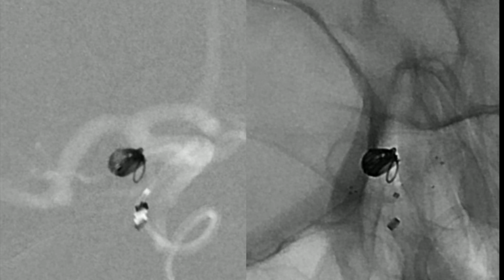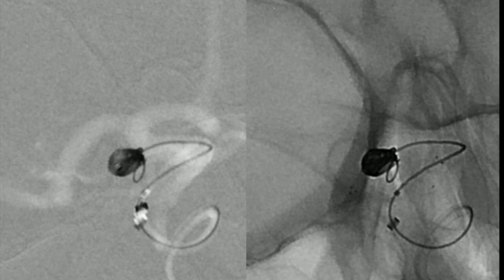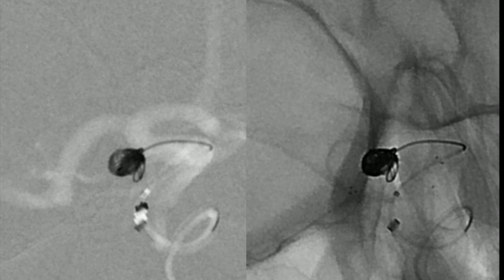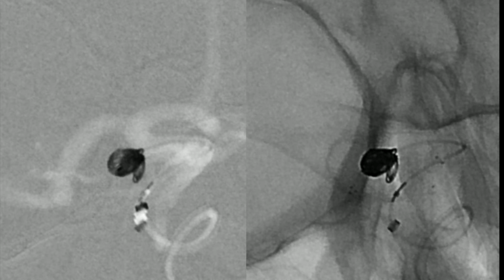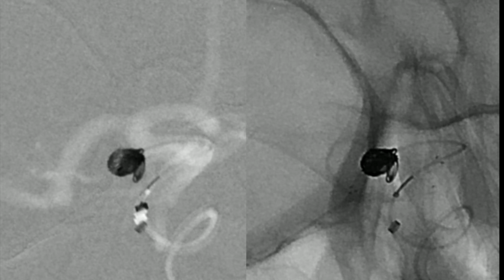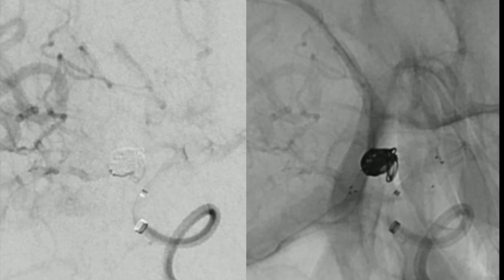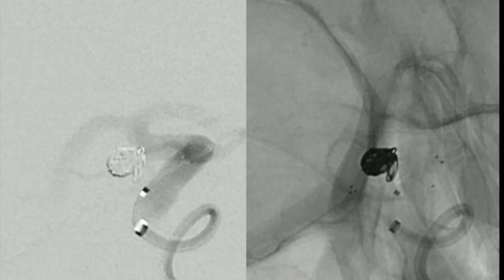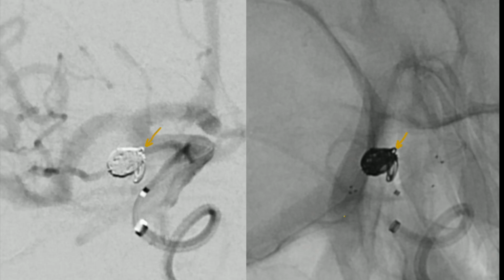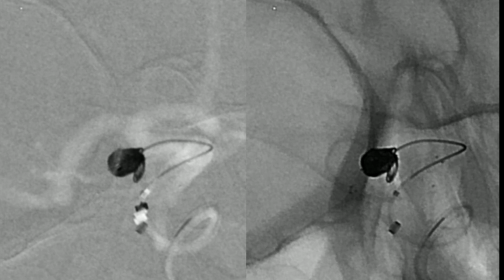And now we pull the pusher and take the next coil. And now it's a little bit easier because we have the framing coil in the aneurysm sac. This is here a 2D angiogram, and as you can see, there is a very small loop of the coil in the lumen of the ICA, and we will correct it later. And now we continue the coiling.